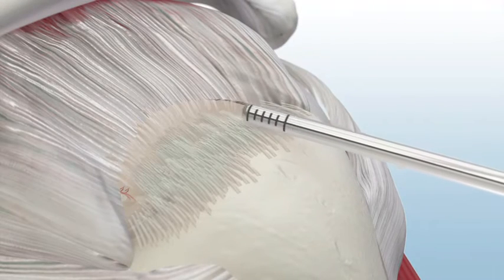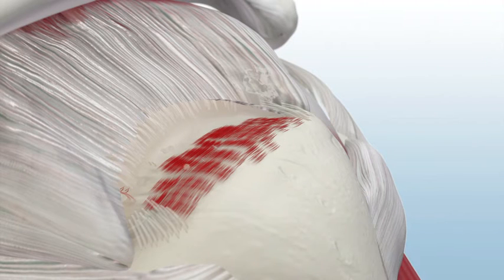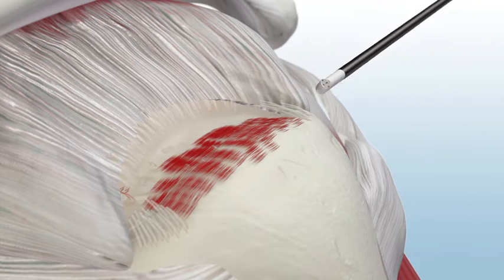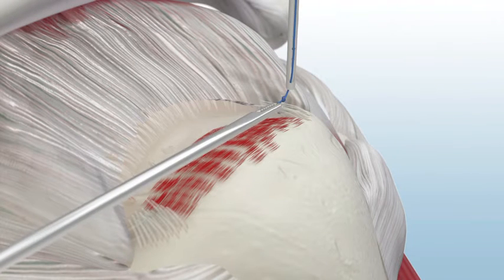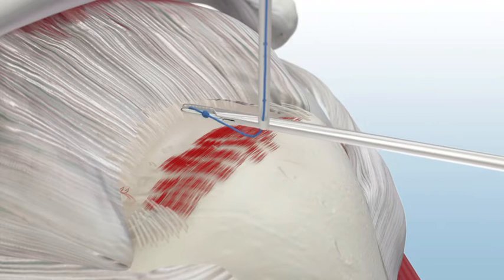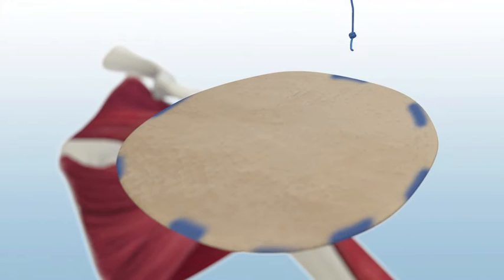First, prepare the footprint and subacromial space using a ConMed dual-purpose shaver blade and the Edge bipolar arthroscopic RF device. Then, measure the tear size from anterior to posterior and medial to lateral. Then, cut the AlloPatch to size and round the edges.